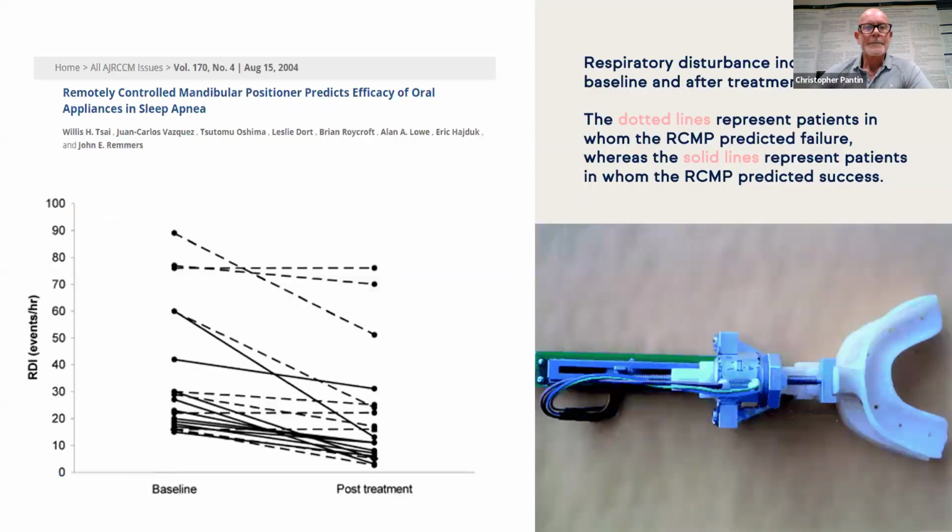Okay, remotely. This is a study that was done looking at a remotely controlled positioner during sleep.